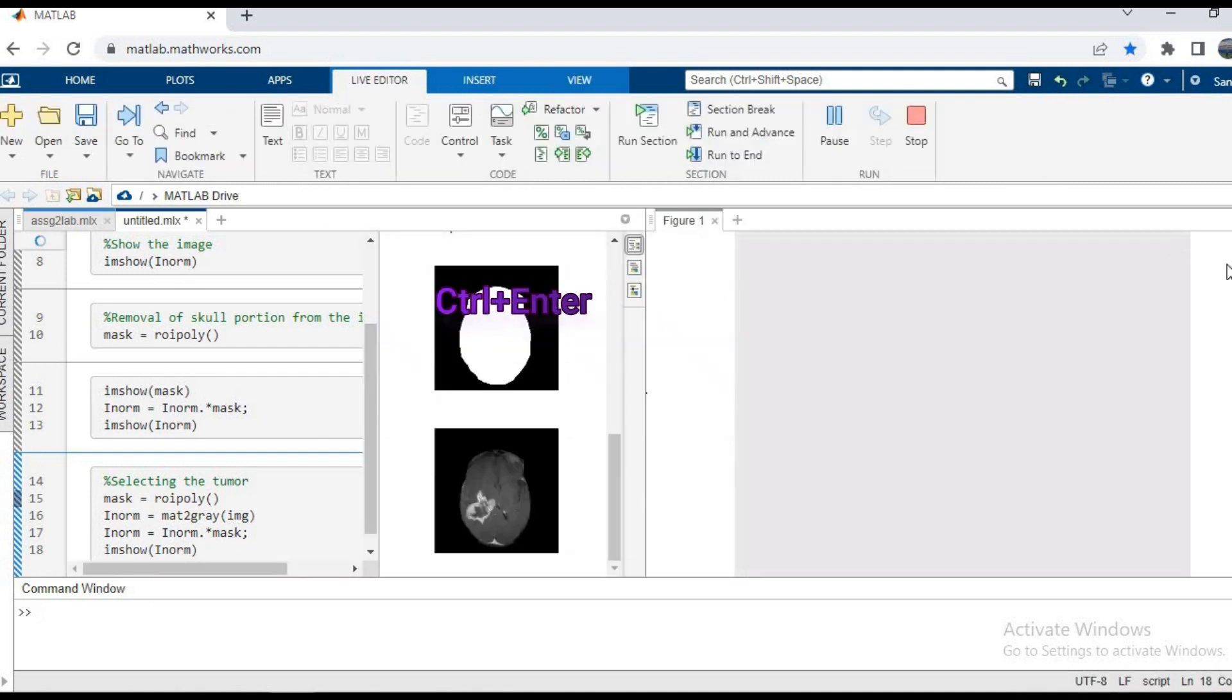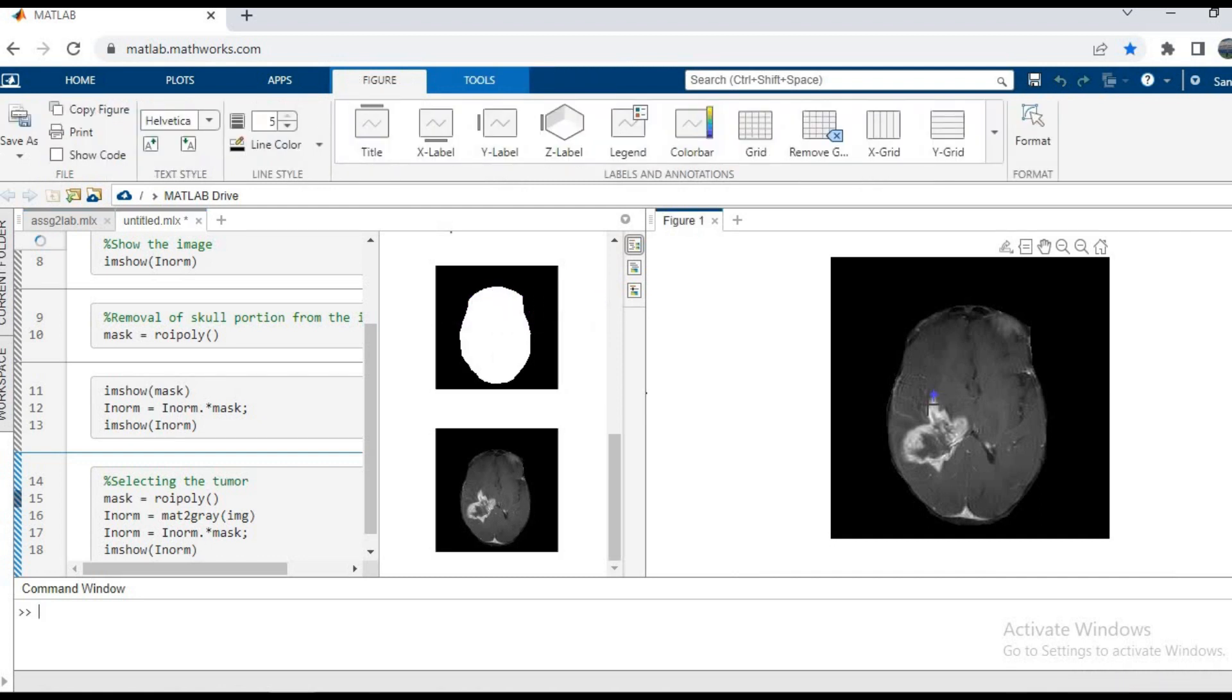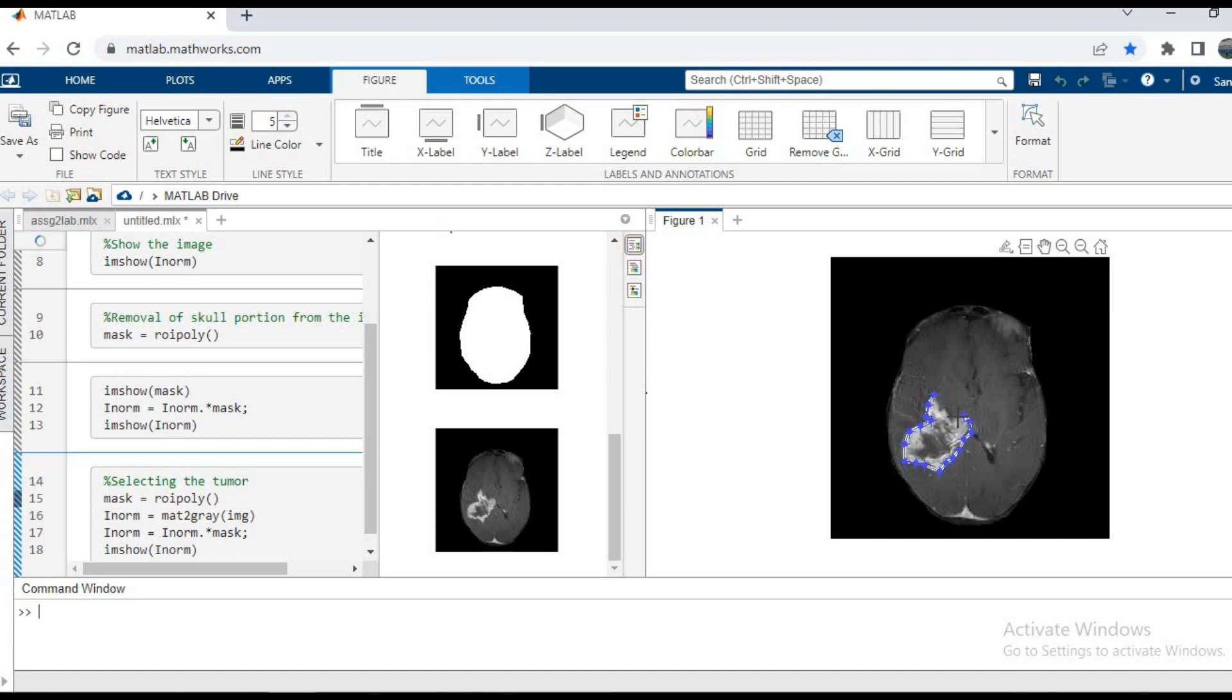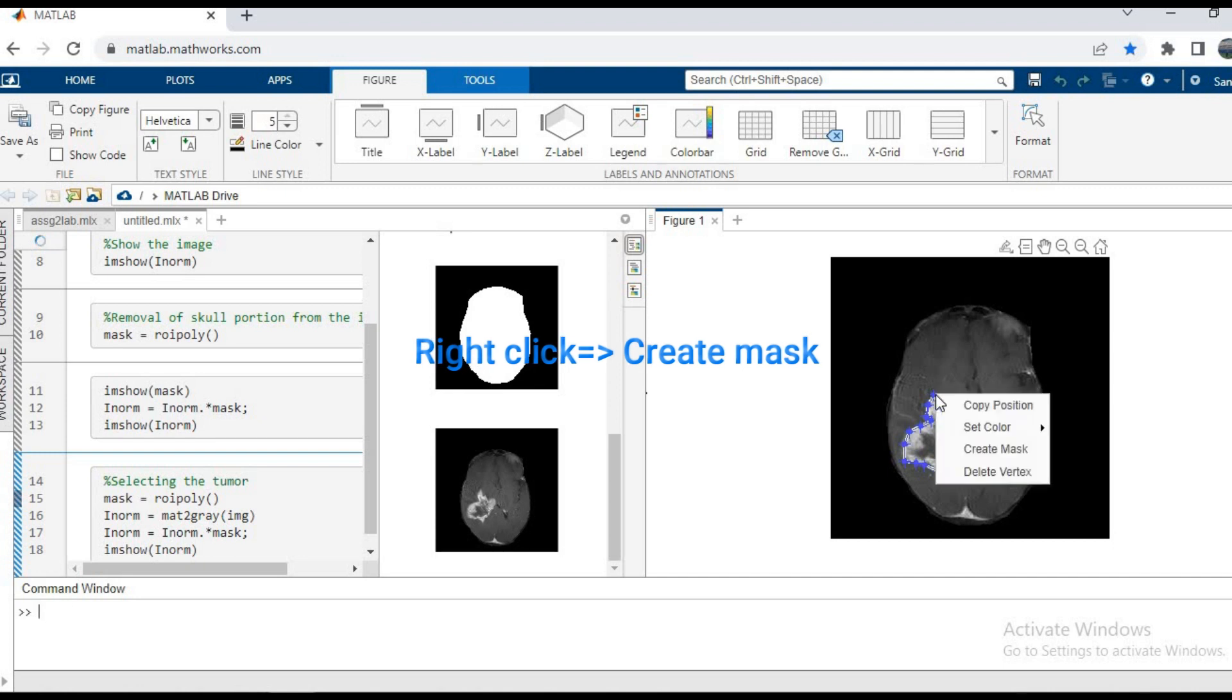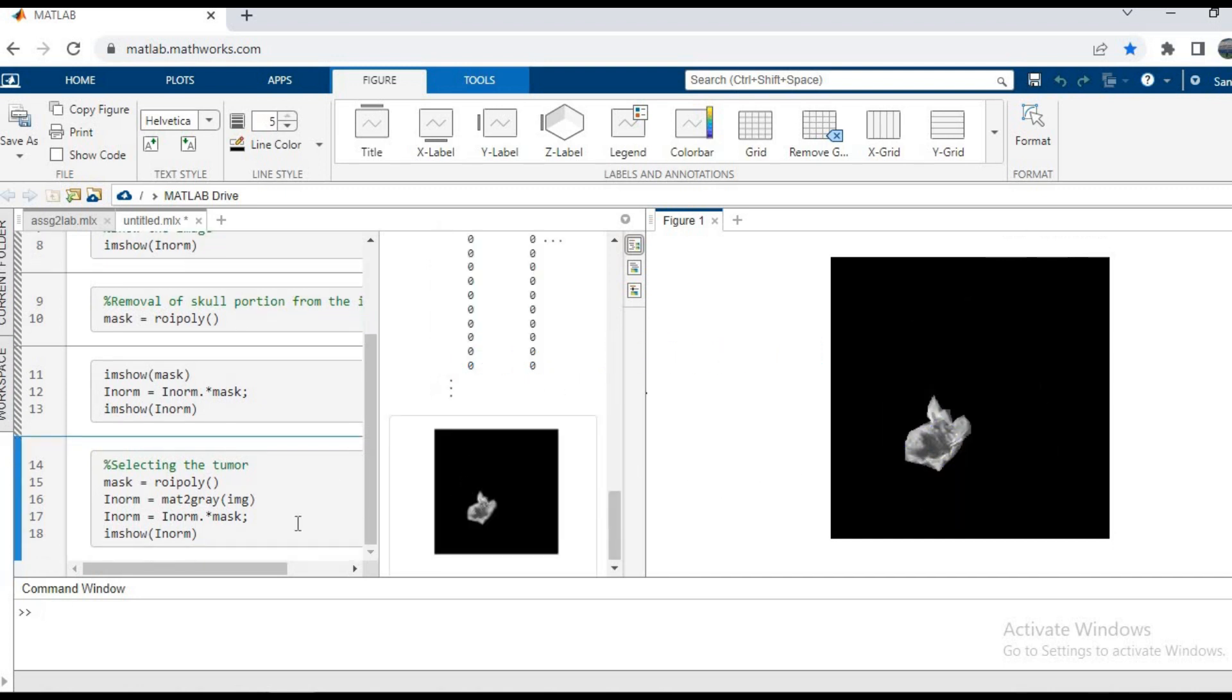As you can see we get this figure on our output window, and then using the cursor I'm going to select a polygon around my tumor just like we did in the previous case. When I reach the end point, I will get a black circle. When I complete the polygon I get the black circle, I right-click and then choose create mask. As you can see, the imshow function here shows the elementwise multiplication of the inorm image with our mask.